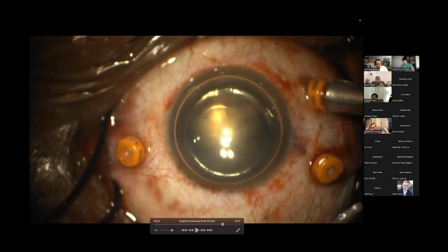Go ahead. All right. So I'll add that, live to fight another day is a good concept there on not taking the lens. And in regards to completing the case, if it's just about putting laser, depending on where your pathology is in a given case, if you're putting in oil anyway, you can hopefully allow the retina to be attached under oil without the more permanent seal of laser. See if you have a view the next day or the next week in the office.